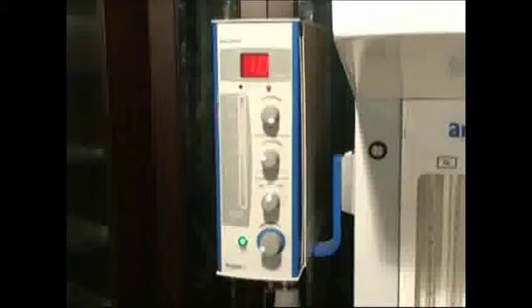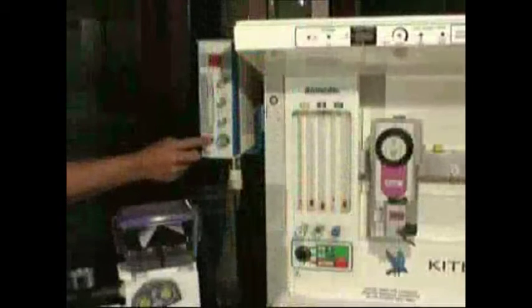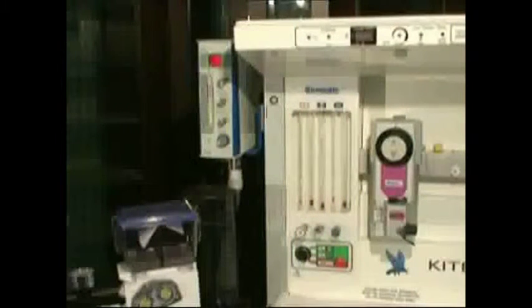Ventilator control. Advanced anesthesia machines are nowadays fitted out with ventilators allowing a wider range of applications. The ventilator integrated in the present anesthesia machine is operated by means of this control console. The control elements are tidal volume control, inhale-exhale ratio control, peak pressure limit control, respiration rate control and its respective LED display, alarm silence button, and pressure display in the form of an LED bar graph.